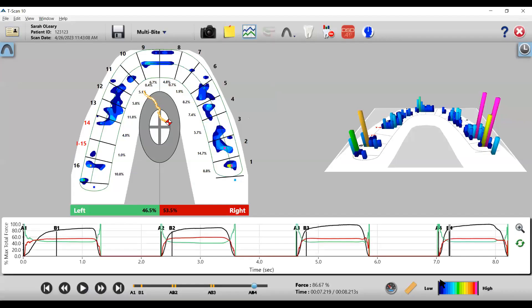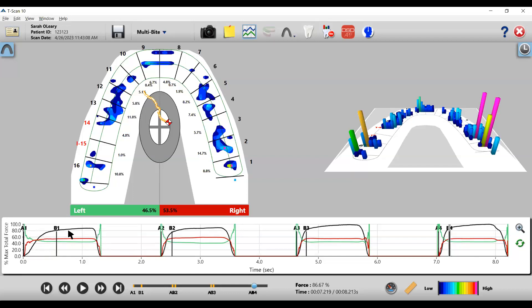I already have a movie loaded and we're going to walk through it. The force time graph at the bottom of your screen is a timeline of the entire scan from zero to about eight seconds — an eight-second scan. In this case, the patient bites four times. Each bite is represented by the force curve, which is the black trace. Wherever the scan rises is when the patient is biting together.